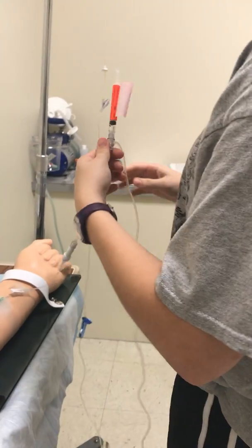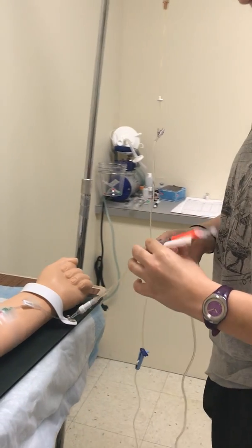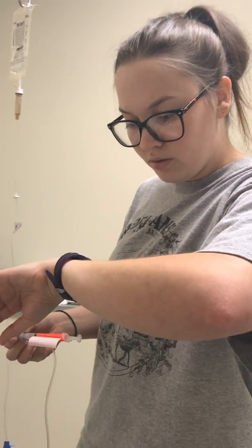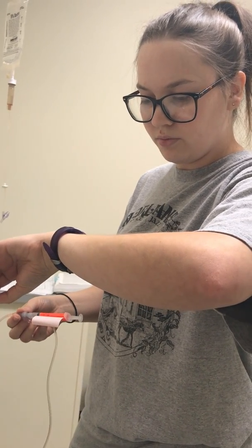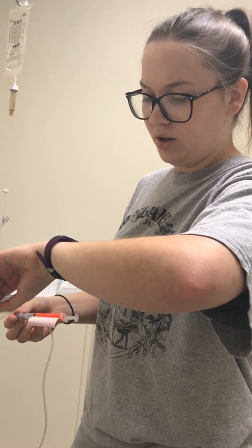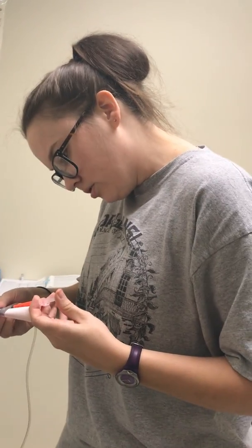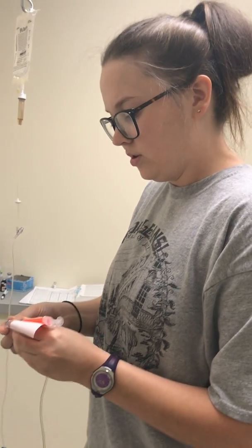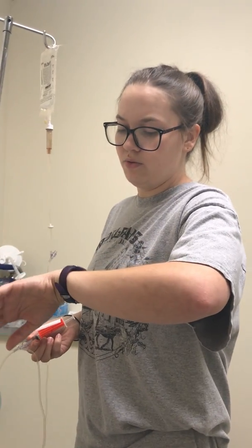Okay, we've got this attached, and now I'm going to begin my time. And now that I've got this kinked, I'm going to administer a little over 1 milliliter. I'm going to unkink it. We're going to wait a full minute until the next dose.